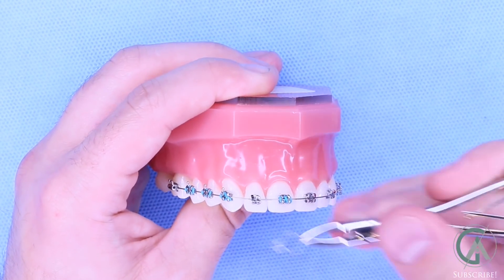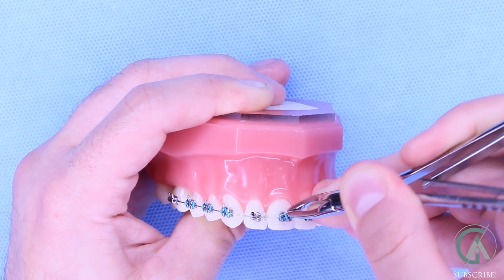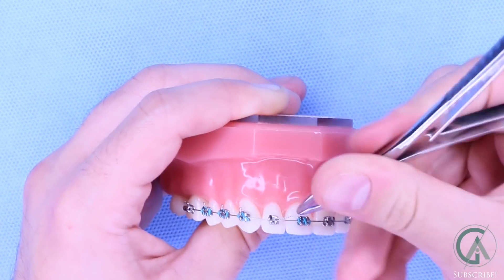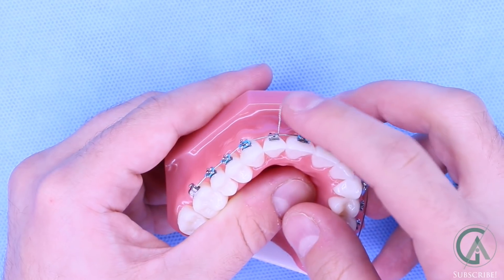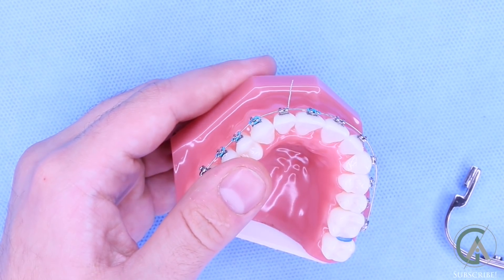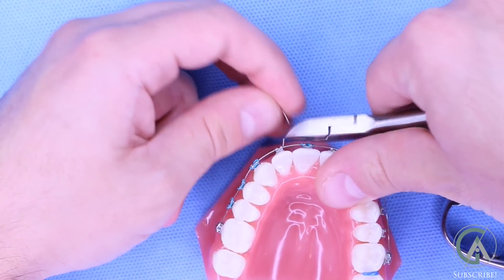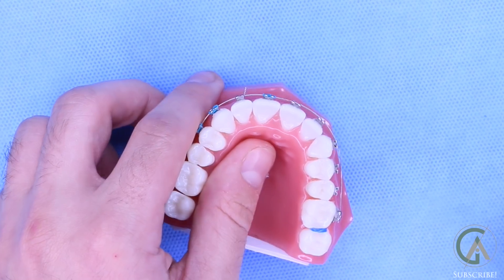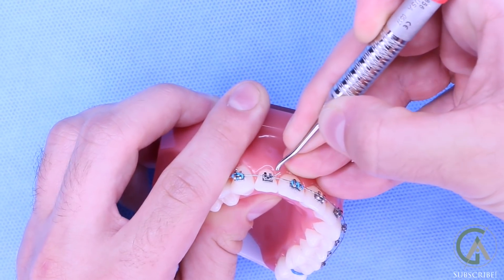What we'll do is grab onto the little pigtail of these shorties, go around a bracket and make sure that all four of the little wings of the bracket are engaged. Then to make sure that it's fully tied in, we'll twist and twist and twist. What will be left at this point is a long little pigtail — a little wire sticking out — but this tooth is fully tied in. Next, we'll cut off the extra, leaving a tiny little pigtail behind just to make sure it doesn't come undone. Then we'll tuck this in so that it doesn't poke your lips under the main wire.